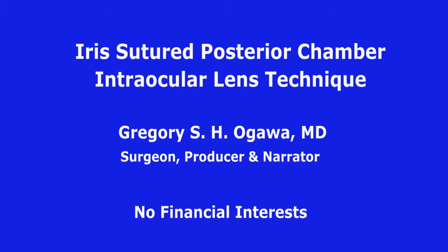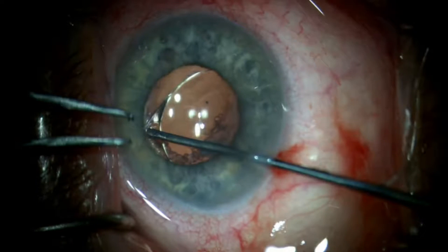This video shows an iris sutured posterior chamber intraocular lens technique by Gregory Ogawa, who has no relevant financial interests. The patient experienced right eye monocular diplopia from a subluxated one-piece piggyback IOL. There was good capsule support for the piggyback, making this a suitable situation for iris fixation.